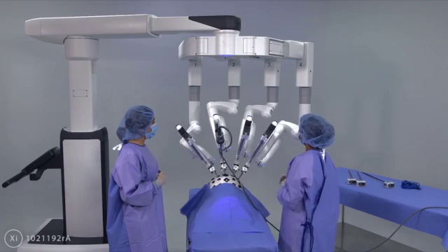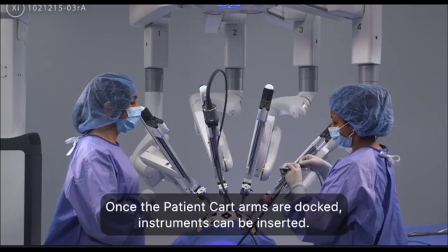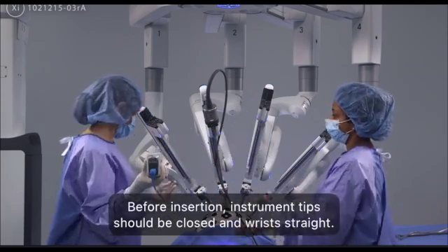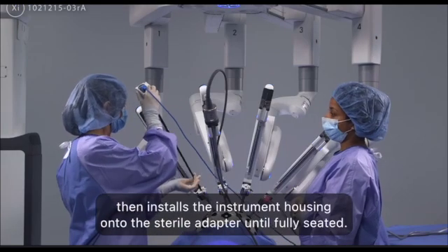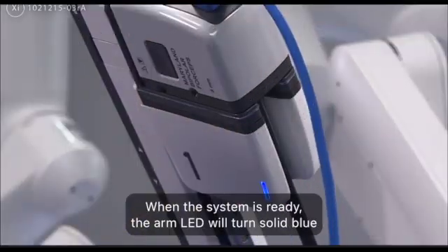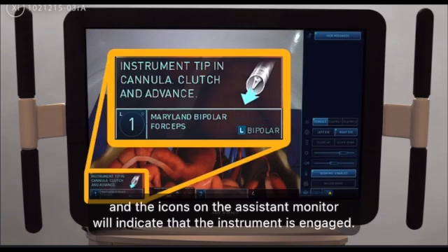Next, instruments may be inserted. Once the patient cart arms are docked, instruments can be inserted. Before insertion, instrument tips should be closed and wrists straight. A sterile staff member inserts the instrument tip into the cannula, then installs the instrument housing onto the sterile adapter until fully seated. When the system is ready, the arm LED will turn solid blue, and the icons on the assistant monitor will indicate that the instrument is engaged.